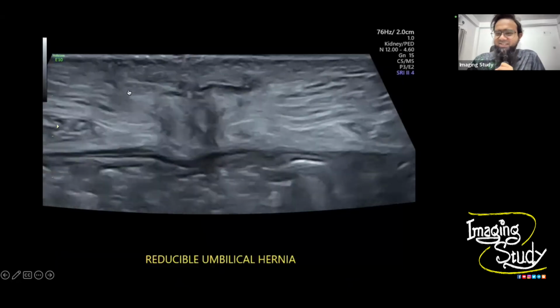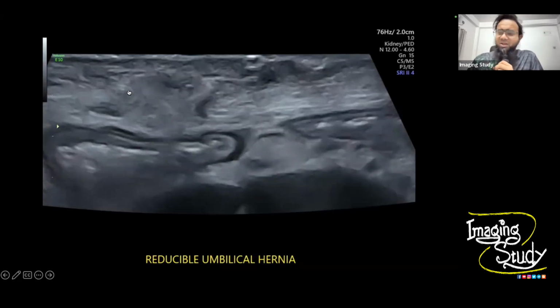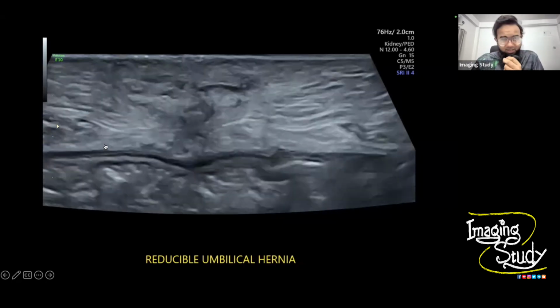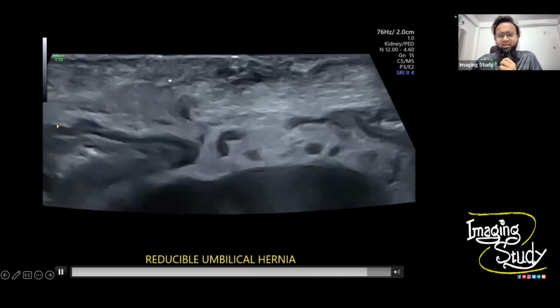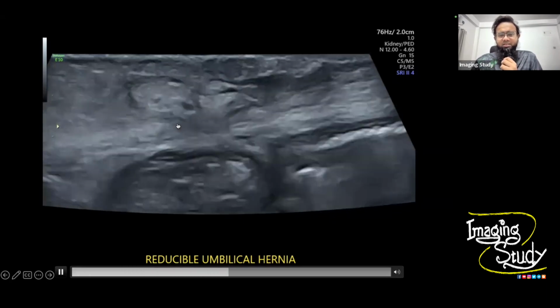Okay, is it okay? No, it's not okay. We searched for the umbilicus actually. We actually search all over the abdomen. So in the umbilicus, there was a hernia at that point. Unfortunately, I just pushed it and it went down. Only the fat content was present in the hernial sac. So I just compressed a little bit.